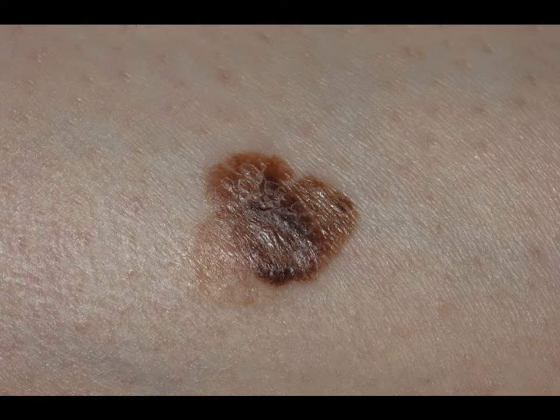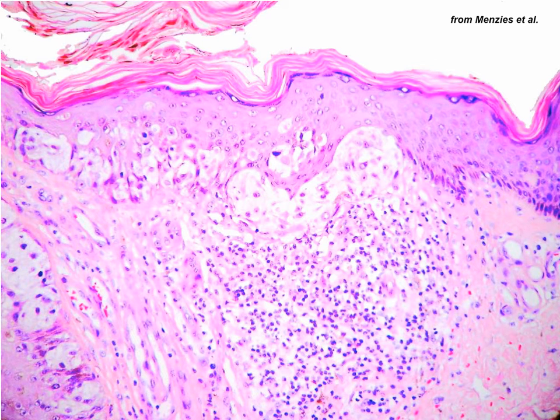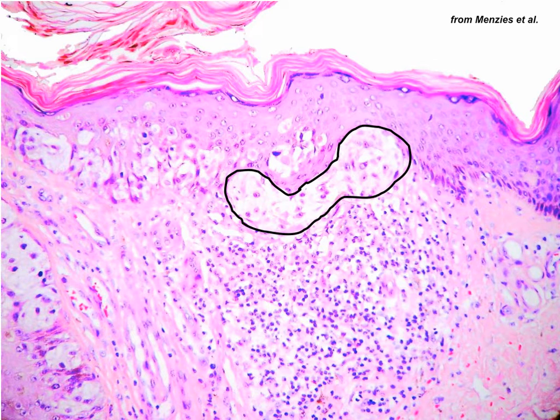Another case of a melanoma: dermoscopically, we see light brown color with variable shades, irregular pigment network, irregular dots and globules. But if we focus on the lower part, we see at 6 o'clock a multitude of pseudopods. At higher power, we can appreciate them even better. This is the histopathological correlation courtesy of Professor Menzies from Sydney. What you see is these horizontal confluent nests of atypical melanocytes situated at the dermoepidermal junction, and towards the periphery, a larger nest corresponding to the knob of the pseudopod.